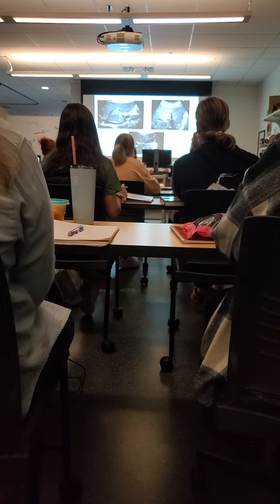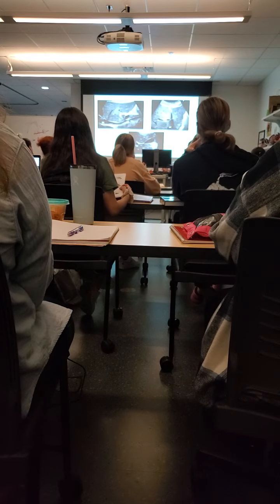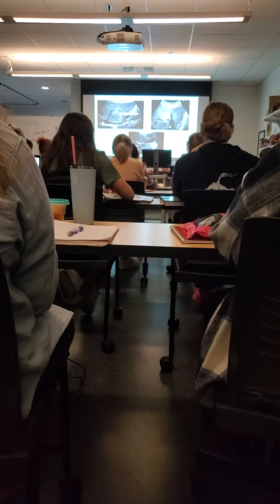So here again are just images. Here's your ligamentum teres. You see how it's kind of like just this little tiny diamond. When you're live, it looks like a diamond. Sometimes it's just like a little triangle. But that's all. Nothing exciting. So when you guys are scanning in your lab and your free time, kind of look and go, okay, can I find these ligaments that we talked about? And it makes it fun. Main lobar fissure definitely is going to come up a lot because we use that for a lot of different landmarks.